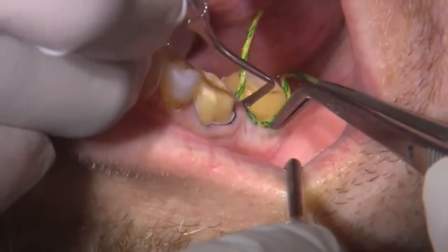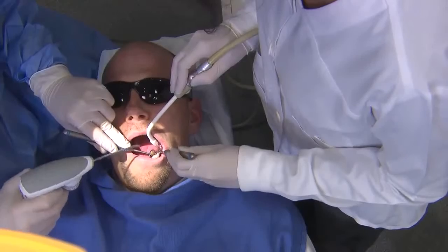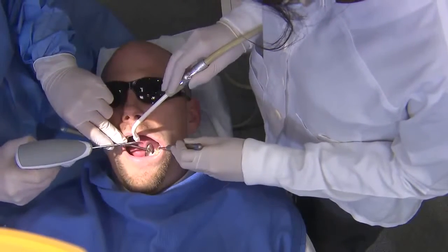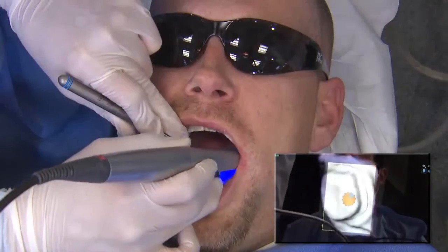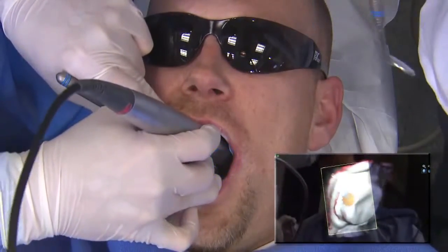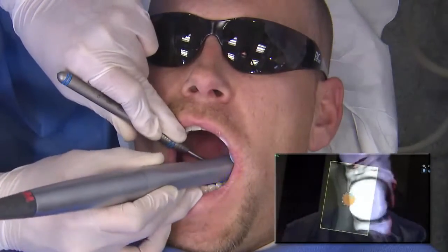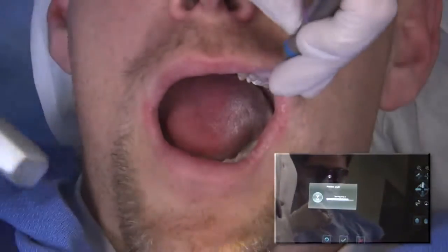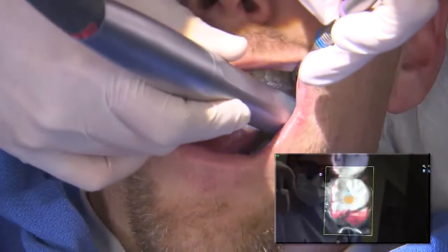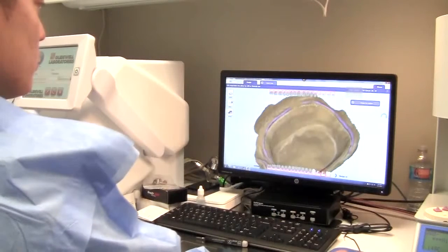If you're doing it conventionally, it's extremely... So we are going to utilize the 3M True Definition intraoral scanner, and I will apply a very light mist of the 3D in motion technology that the 3M TrueDef uses to capture scans. I start off right over tooth number 18. I get the occlusal areas, and I begin my rotations to the buccal and to the linguals of tooth number 20. You want to make sure that that area is acquired as well. And then I just capture the opposing scans, the entire upper left quadrant, design proposals properly over the preps.